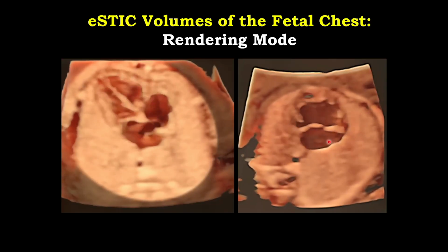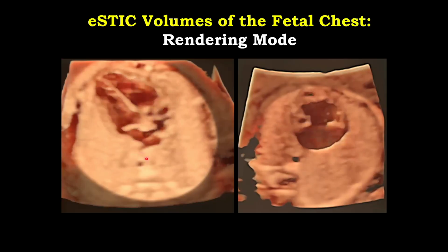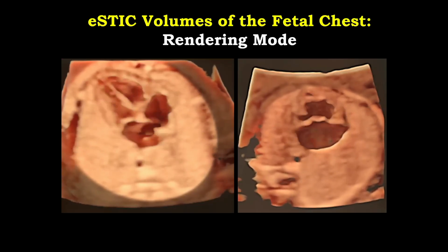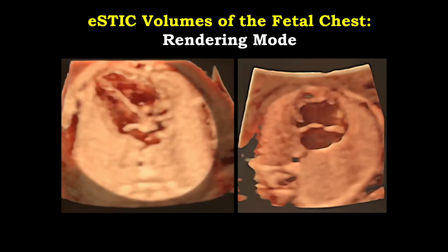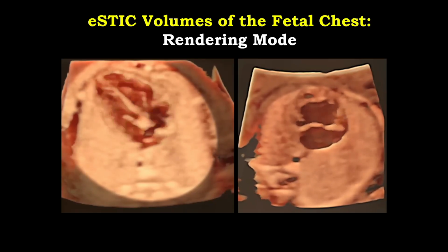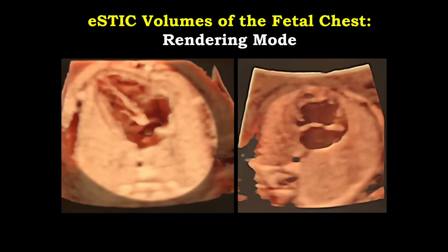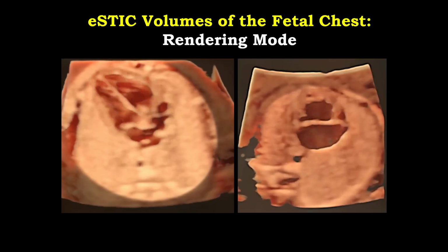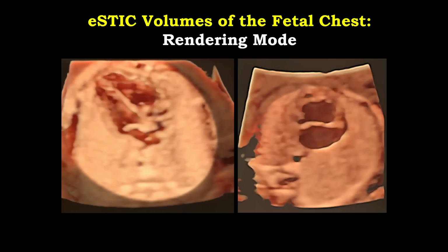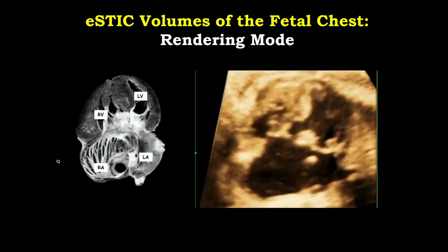For example, how the inferior vena cava is connected as well, and we can compare that to the normal anatomy that is presented here. All this can ease not just the understanding of the complex anatomy of this heart defect, but very often can help you to communicate better with other subspecialists, for example, pediatric cardiologists and the surgeons, and explain this more effectively to the patients. So this is another example of the AV canal.